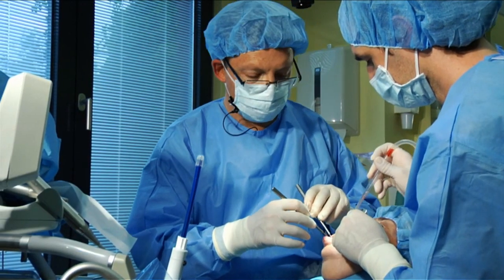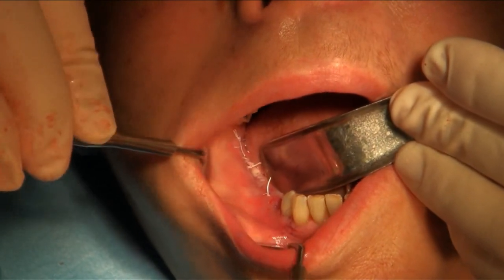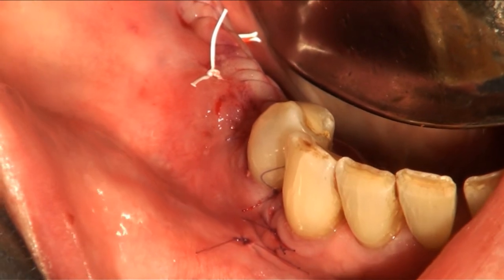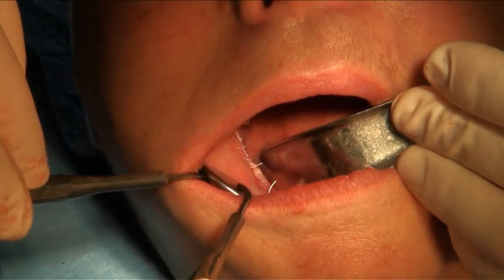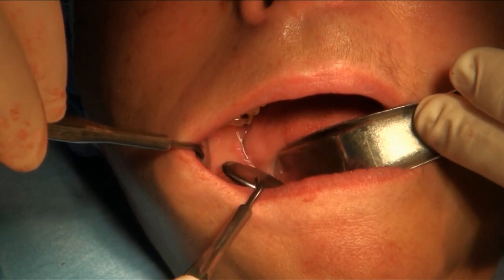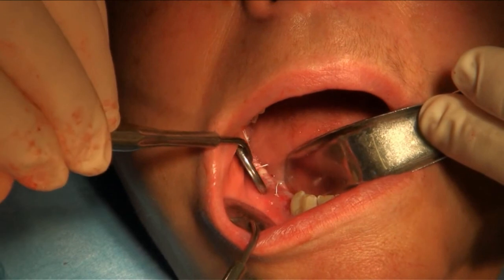Okay, so now we achieved complete soft tissue closure all over the space, a full flap adaptation, and there is no tension in the flap tissues, as you can see here by touching the flap from both sides.